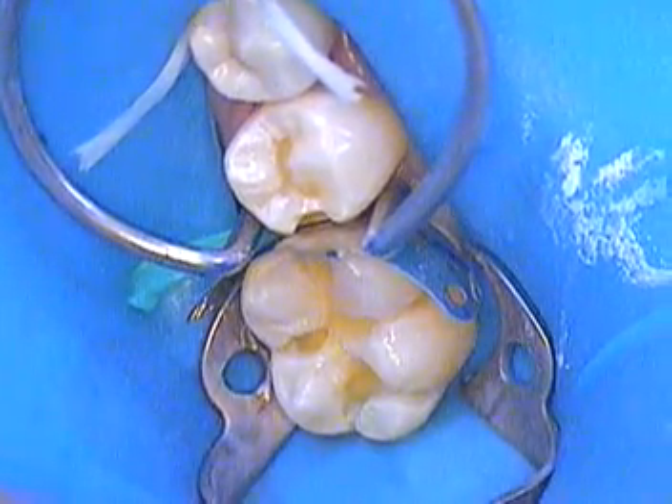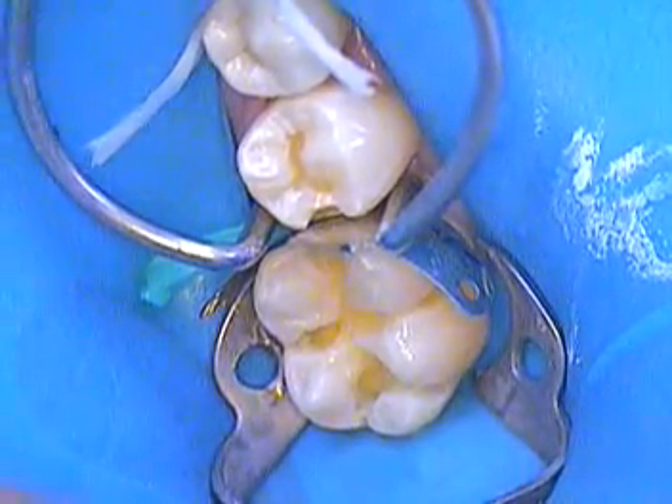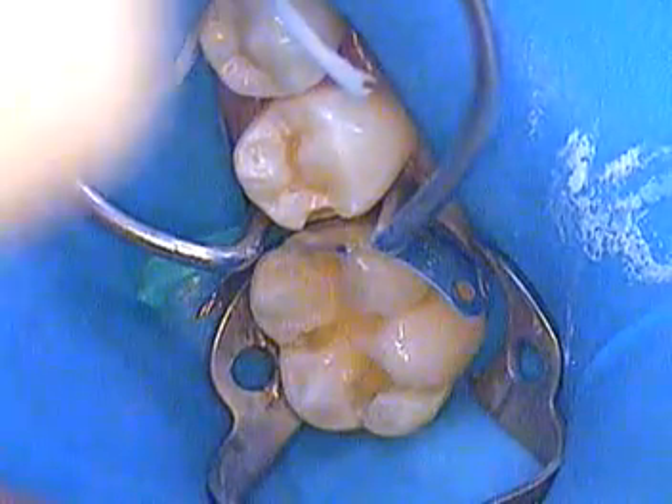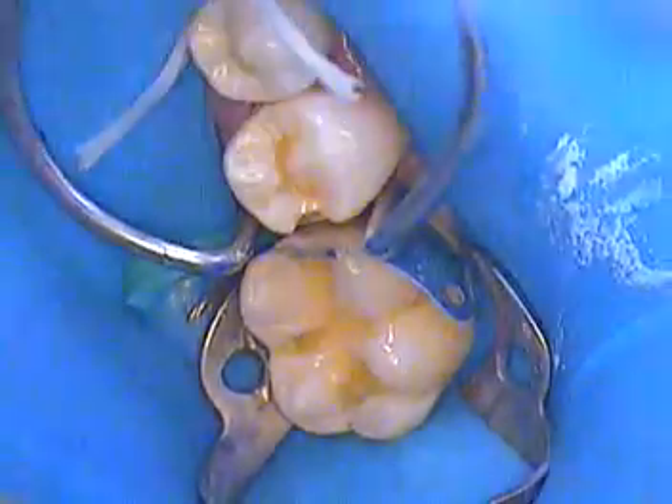Hello and welcome back. This is Dr. Jerry Cuomo in the second of two videos that we're doing on the lower right teeth, numbers 29 and 30.